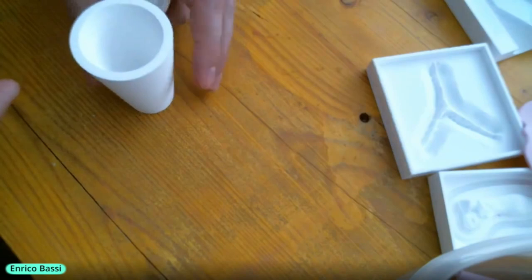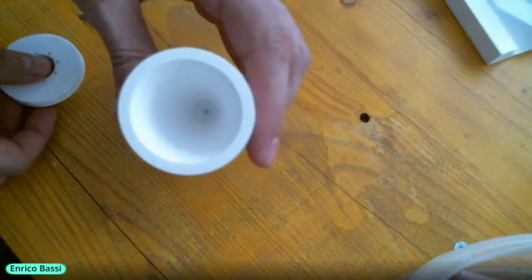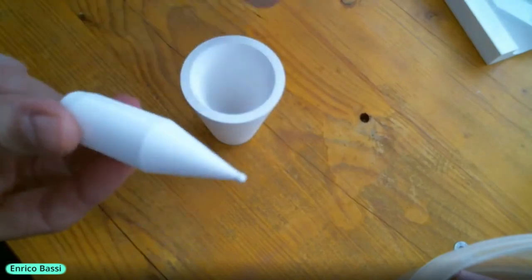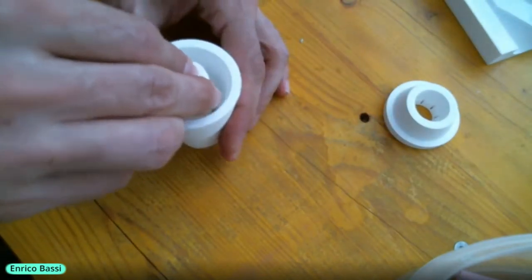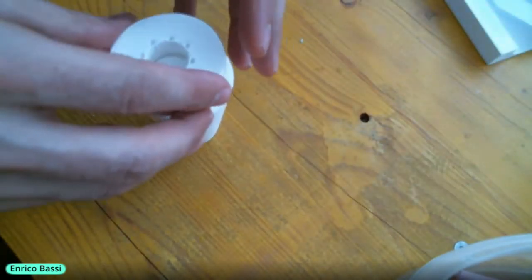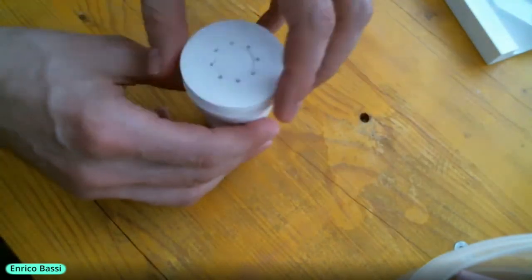So one interesting example is this. This is a compression mold. So it's designed without the holes to inject the material and so on. You just pour the resin, the silicone inside. Then you have three parts. Okay, so you pour the silicone inside, you squeeze this here. This, of course, pushes up the resin, and then when you press everything together, you compress out the silicone from this hole, and you get the object.